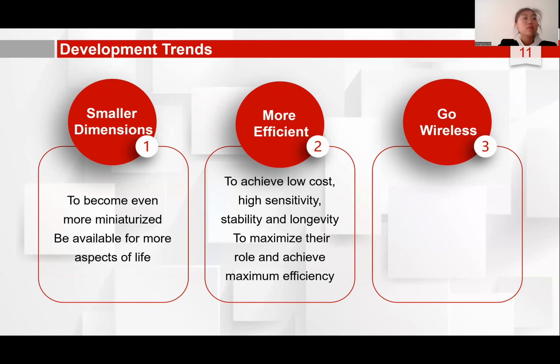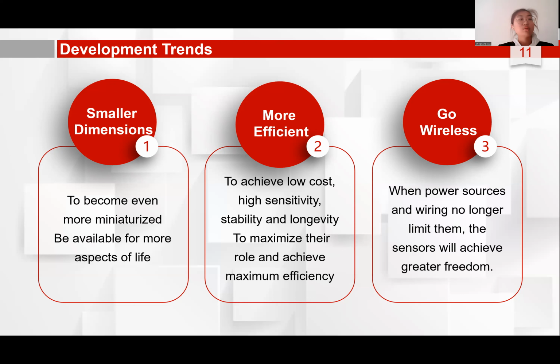And thirdly, go wireless. The dependence on wires and power sources often limits the environment in which the sensor can be used. So if the wireless issue could be addressed, this would greatly facilitate the use of glucose biosensors. And in the future, when power sources and wiring no longer limit them, the sensors will achieve greater freedom.